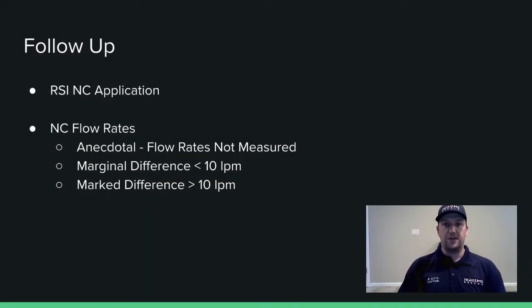Follow up on the two videos that you just watched. For the RSI nasal cannula application video, I just want to hit home that only the non-end-tidal cannula will have oxygen flowing through it. The end-tidal cannula is simply to measure if the patient's still breathing and get an end-tidal.